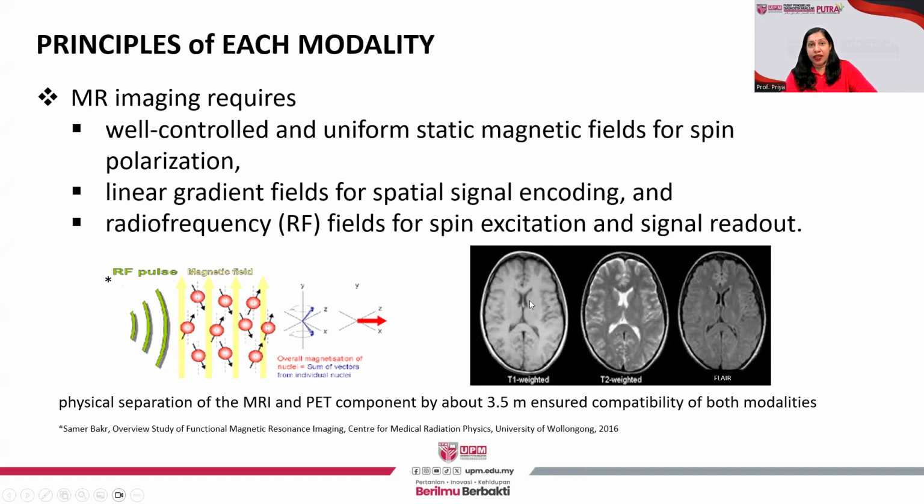For example, an RF pulse can give a T1 weighted image, where you can see water is dark, also known as hypointense, as in the CSF in the ventricles. This T1 weighted image also shows dark gray matter in the cortex of the cerebrum, and the white matter is relatively brighter. Whereas in a T2 weighted MR image, the CSF or fluid inside the ventricles is bright, also known as hyperintense.